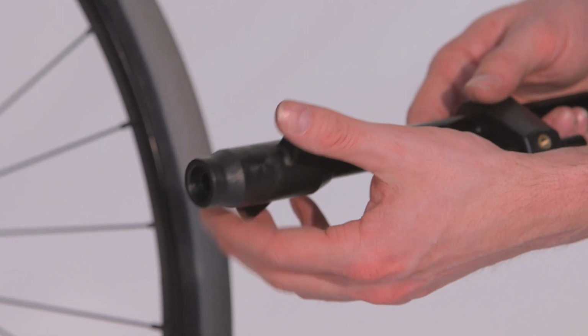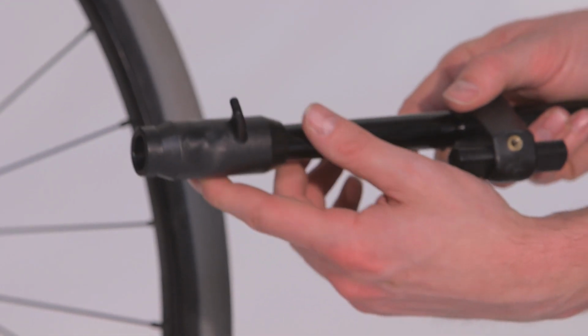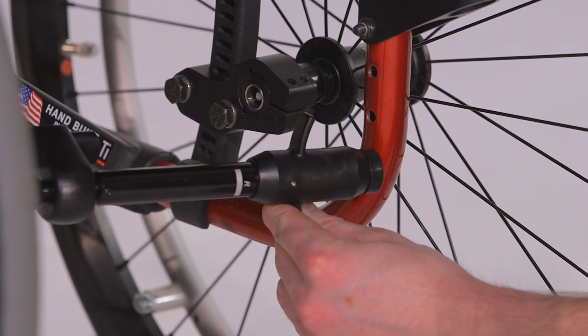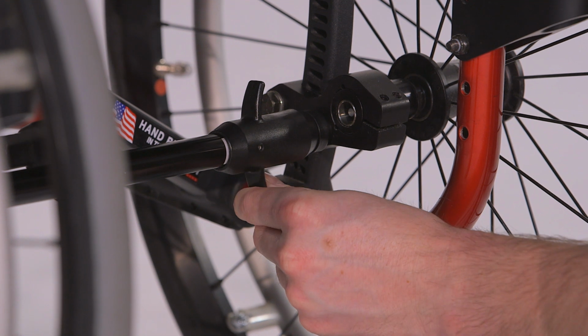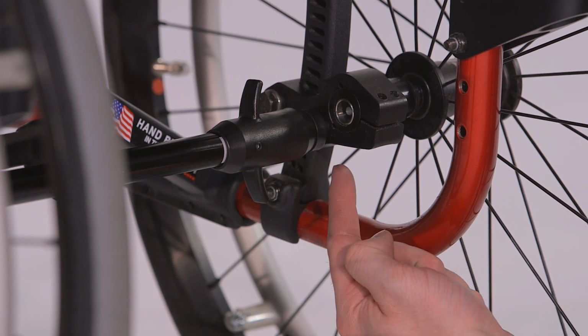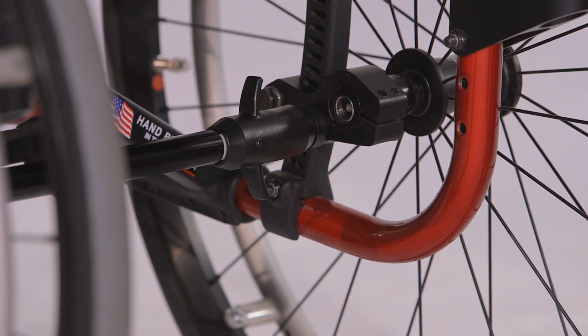Now, the folder adapter bar attaches to the wheelchair in the same way. You'll want to be sure the bolt head or nut that you are engaging is as close to rear wheel axle height as possible, and also that there is a correct end cap preload for ideal performance.